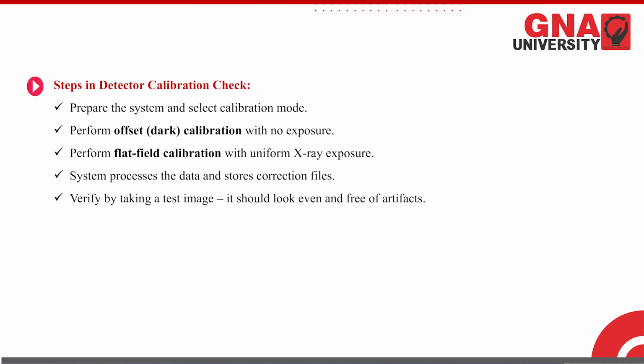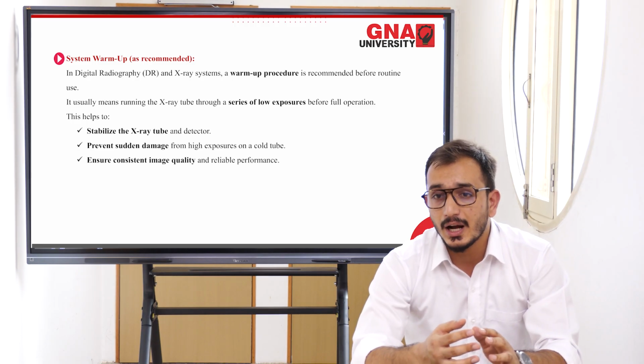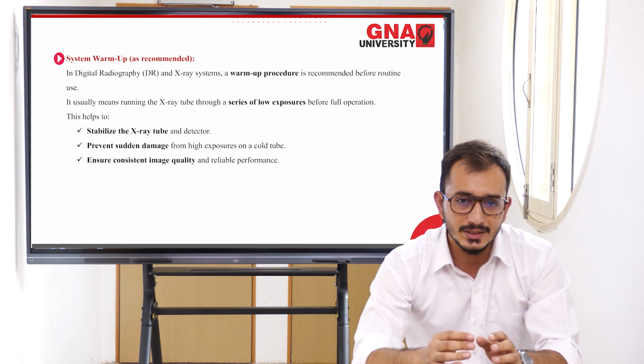And the next test which we perform on a daily basis in the machine is system warm up.